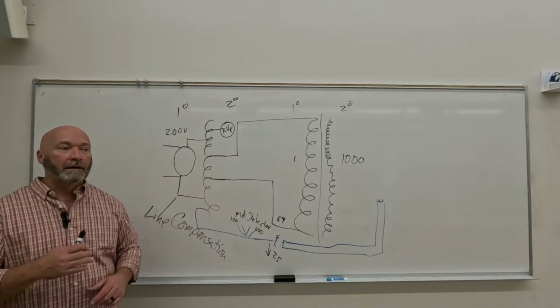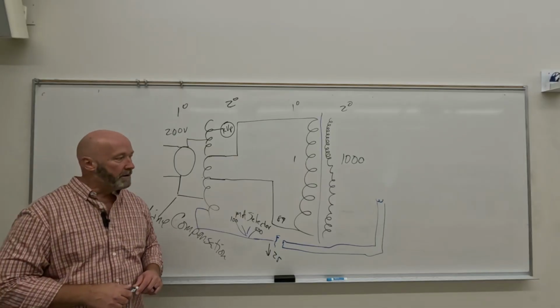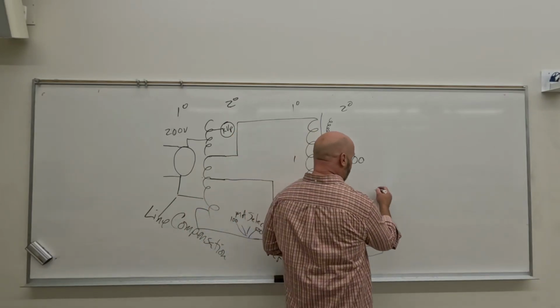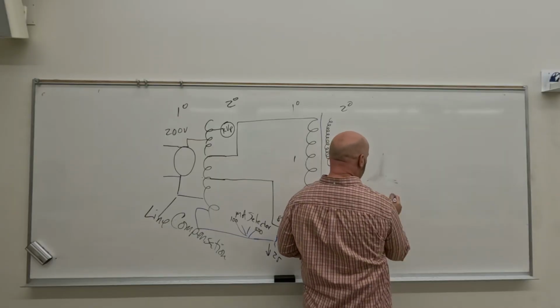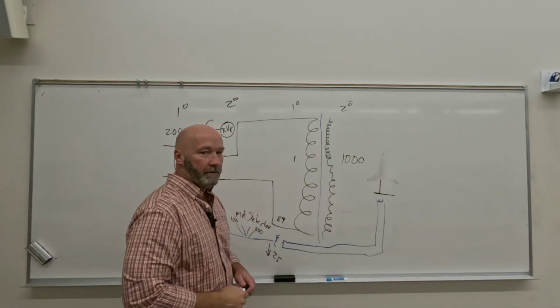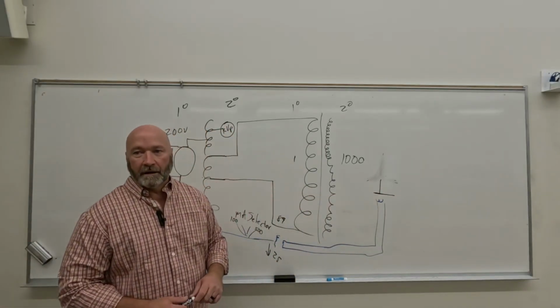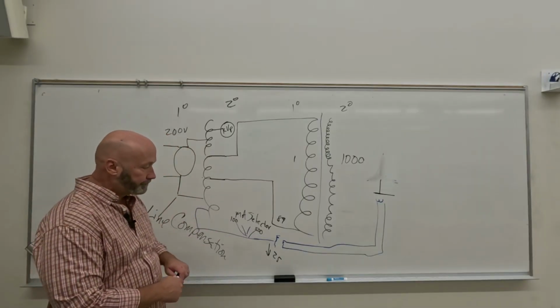What is voltage control in the X-ray tube? So the electrons don't get shot into the... Bingo. We don't want the electrons to shoot across the tube before we're ready for them to shoot across the tube, right? And the distance between here and the anode, I know I draw it like that, and it's nowhere near that. It's like that, really pretty close. And we don't want that to happen, so we need low voltage. If we sent 220 volts through that, we'd have issues. Okay, so we got to drop it. It's going to drop to like 25 volts.